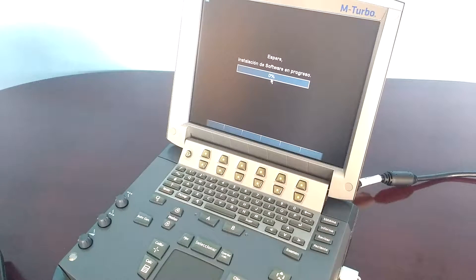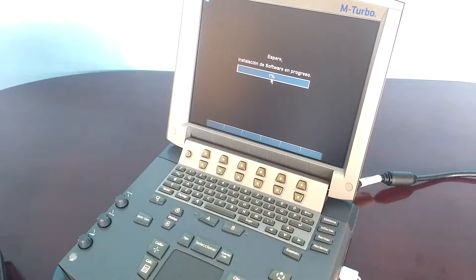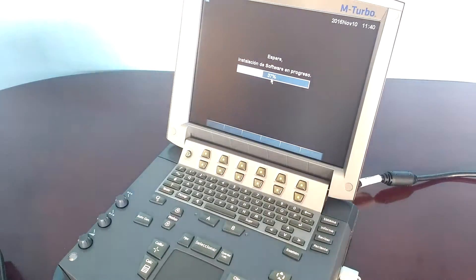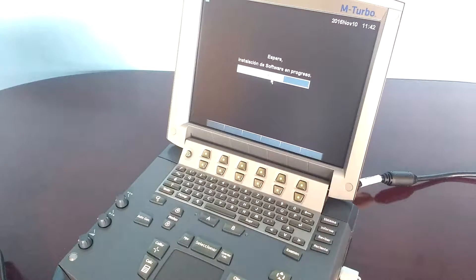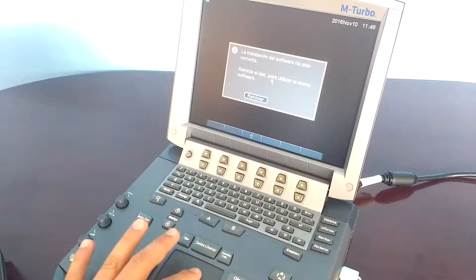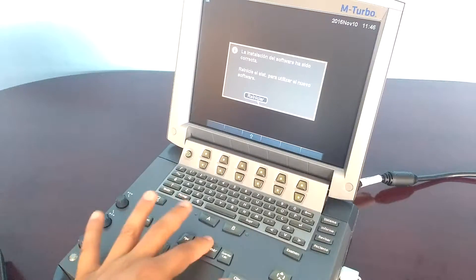I'm going to speed up the video to make it shorter. Click on reboot.